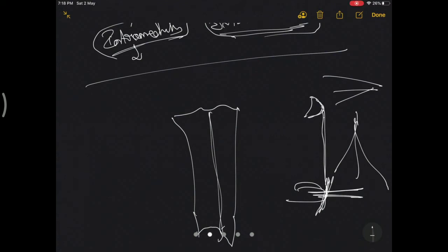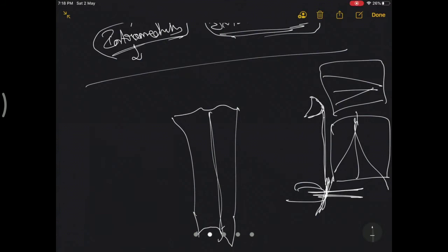Rotation is important when you are implanting the prosthesis. For the proximal tibial cut, you have to precisely adjust the slope and the varus or valgus cut. As we studied yesterday, most surgeons will align to the mechanical alignment, so we will take a cut perpendicular to the mechanical axis of the tibia.